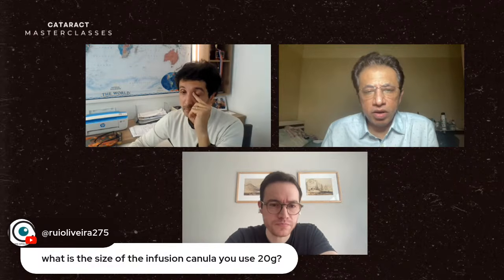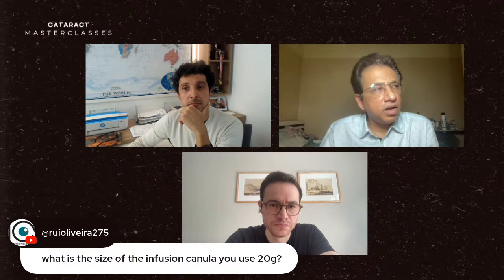Next one. The size of the infusion cannula to use, 20 gauge? This is the regular one which we use for our bimanual irrigation aspiration. It is 22 gauge. Mine is 22 gauge.